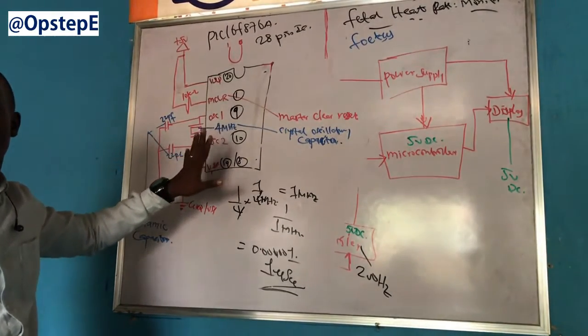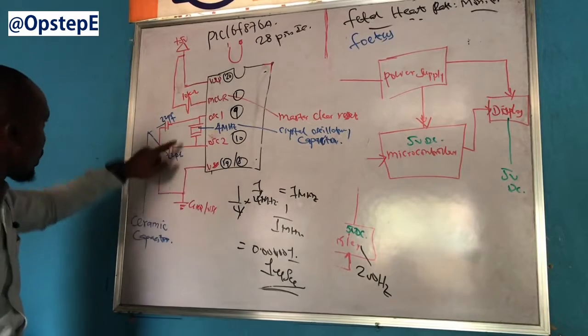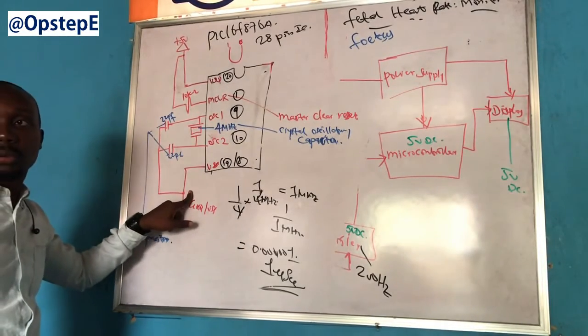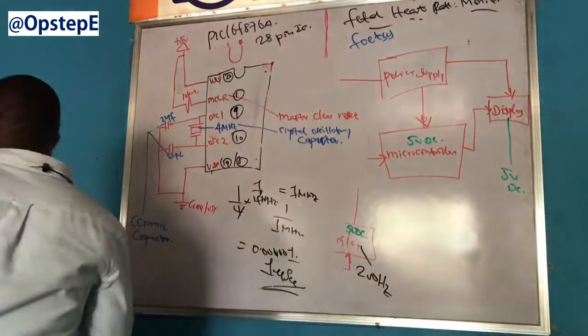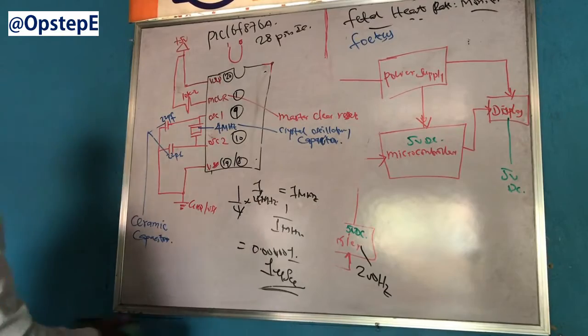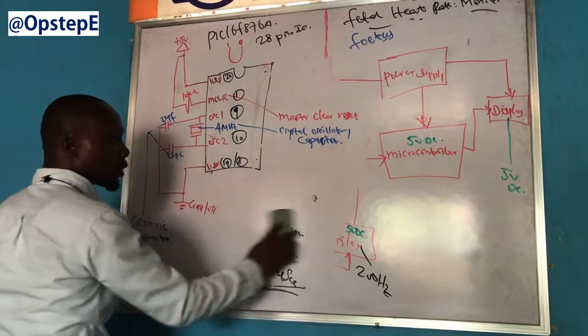Okay, so it's not connected to the ground? Yeah, it's connected to ground. This end, not connected to the ground. Does it make sense? Now, can I continue? Now, before I clean this up, let me just clear this out.